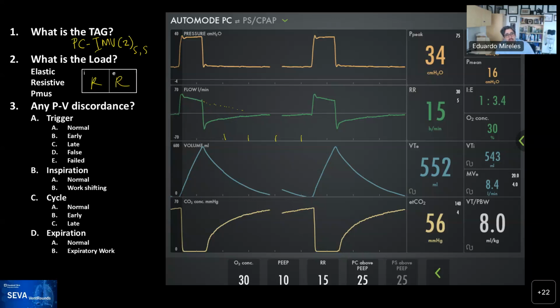And so the faster the rate, those units will not be able to empty out. They will remain, increasing the dead space. So by doing this, you decrease the efficiency of your breath in eliminating the end-tidal CO2. And actually, with this ventilator, we are also able to measure the volumetric CO2 and titrate a little bit better. In this case, there's no patient-ventilator interaction.